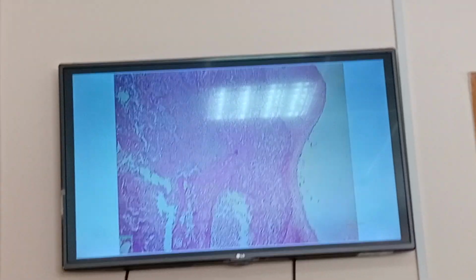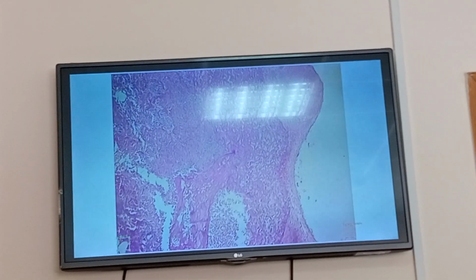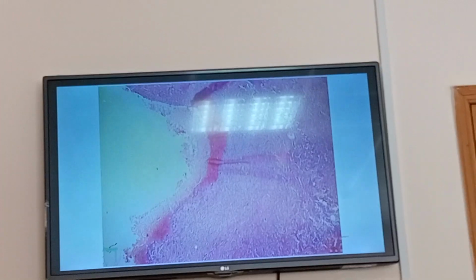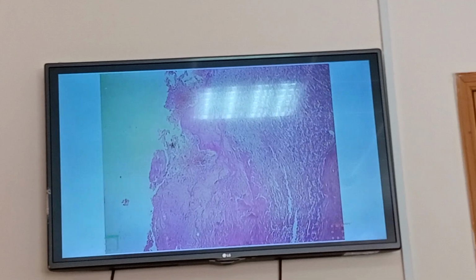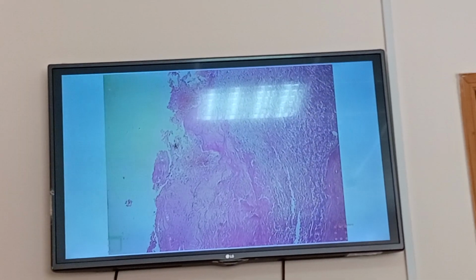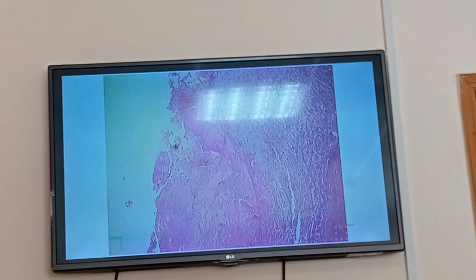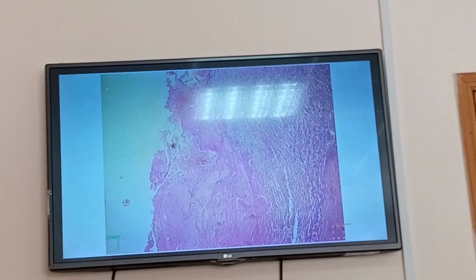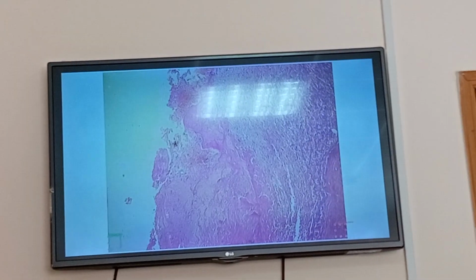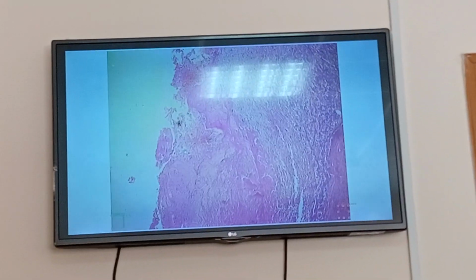We can see with you fibrinous necrosis, infiltration by inflammatory cells. Vegetations of the valve. Remember what vegetation is? On the valve, like planted areas due to thrombus formation, for example, due to damage of the wall of the endocardium.